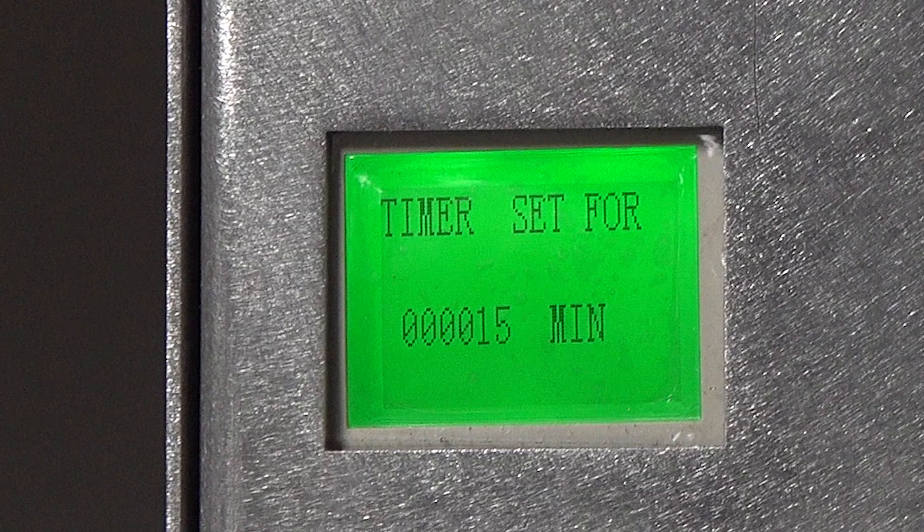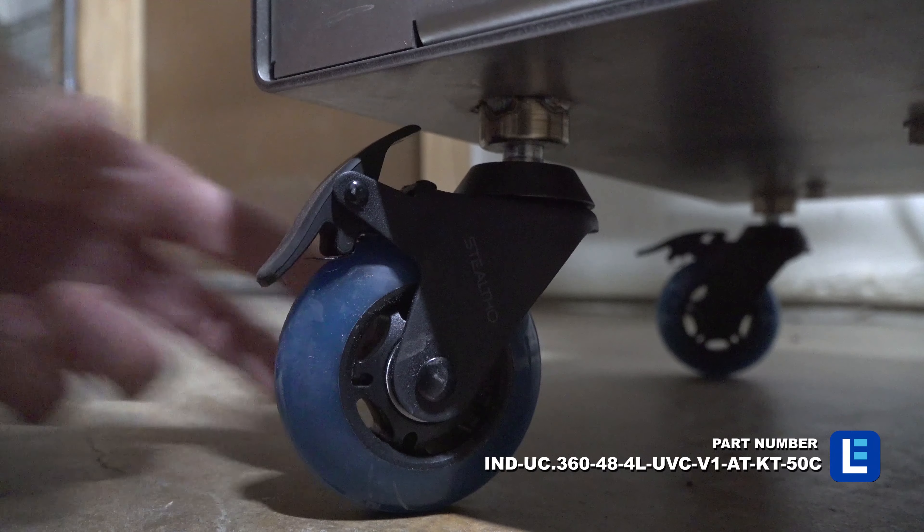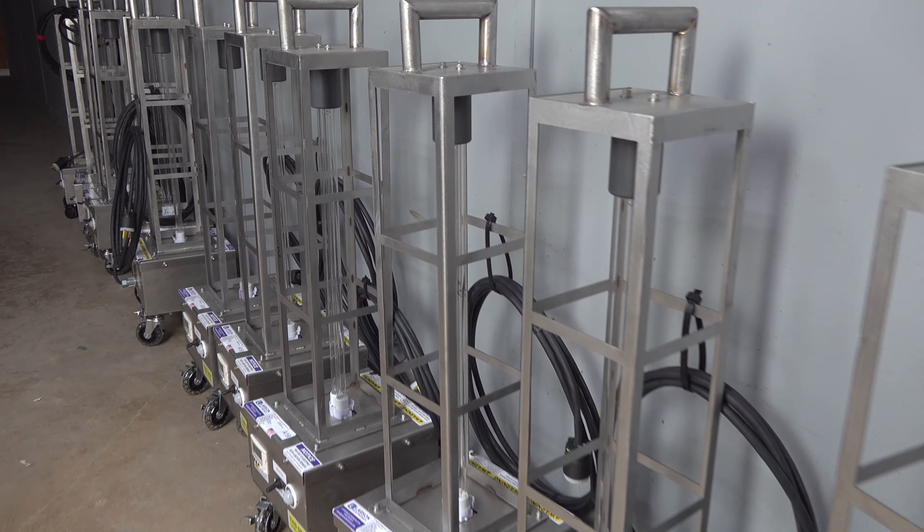UV carts with timers enable scheduled cleaning. These units are secured on a wheeled base or have a top-located handle for mobility around the building.